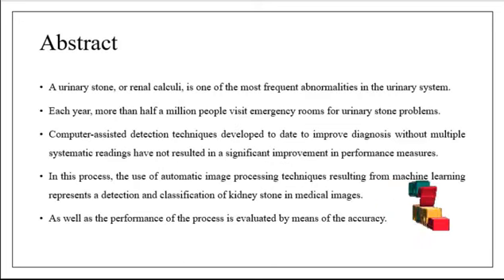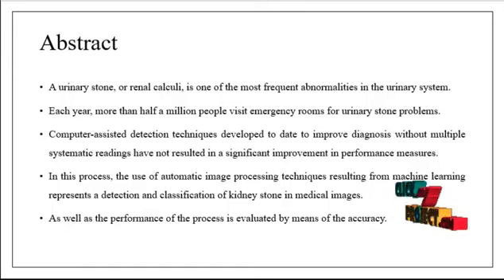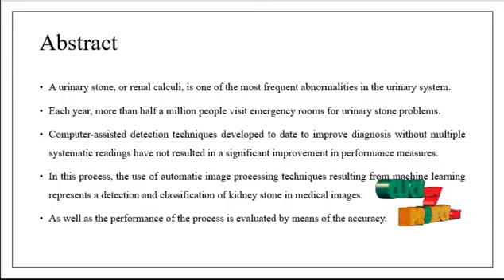Now we are going to discuss the abstract of the process. A urinary stone or renal calculi is one of the most frequent abnormalities in the urinary system. Each year, more than 500,000 people visit the emergency rooms for urinary stone problems. Computer-aided detection techniques developed to improve the diagnosis without multiple systematic readings have not resulted in significant improvements in performance measures.